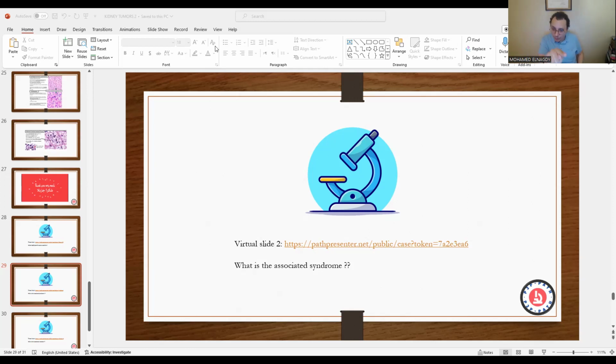So I go over, well, chromophobe carcinoma. And I mark with a highlighter the key microscopic features, like a plant-like cell membrane, perinuclear halo, and a nucleus which is paper tissue or crumpled paper-like nucleus. And then you jump into the next entity. Don't care about the key facts. You will try to study these and memorize them later, but just make your revision as layers.